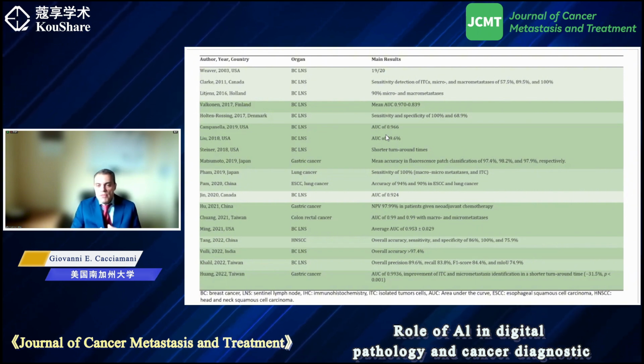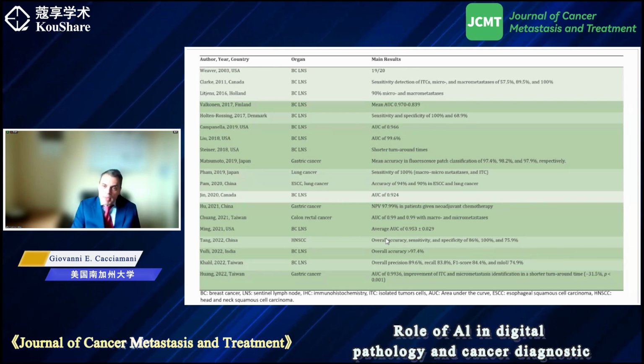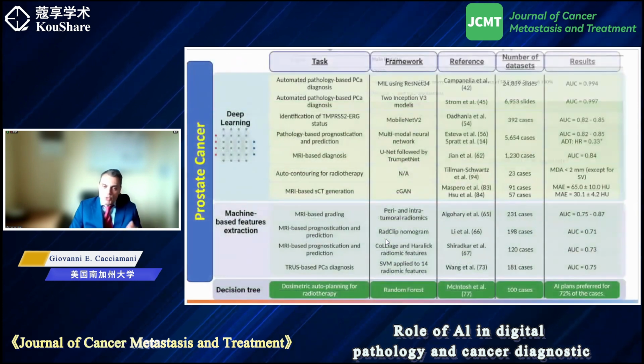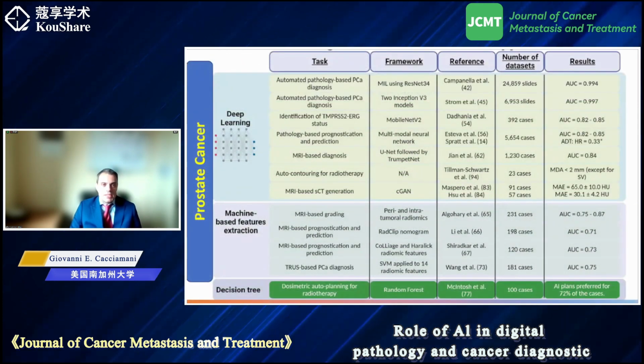If it's an obvious metastasis, it could be easy to recognize. But on the other hand, recognition of easy patterns could make the job of pathologists easier just by solving easy cases and leaving the time to pathologists for the more complicated ones. So I would not neglect the possibility of easy recognition of obvious pathologies in some instances.